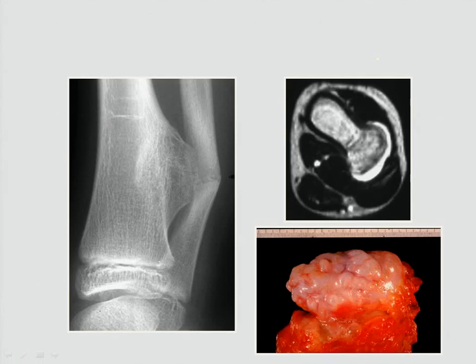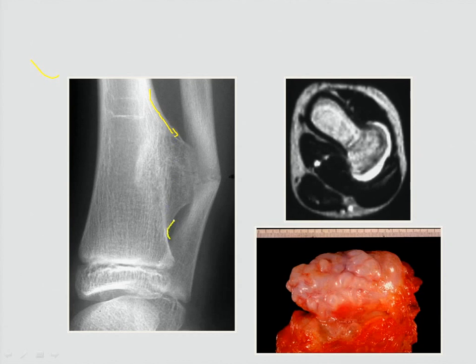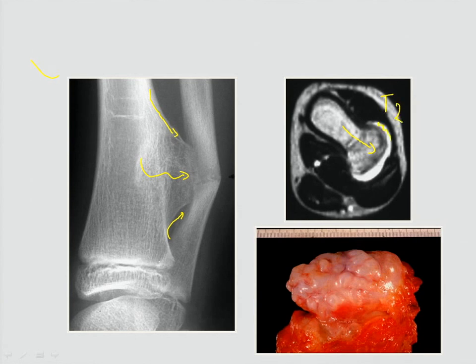Here we have an example of another type of tumor. You see the tibia, and when you look at the cortex, you see the cortex going further and the bone going into the lesion. You can also see that on MRI. On T2 images you will see a white cap, and that white cap is cartilage. So it's osteocartilaginous exostosis.